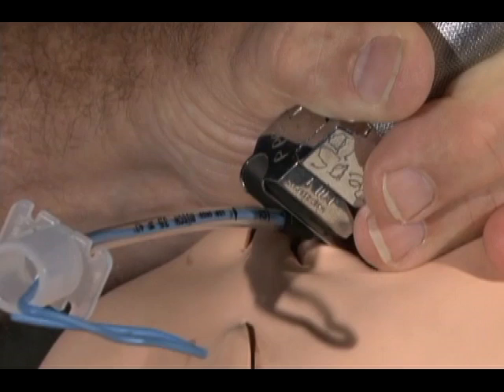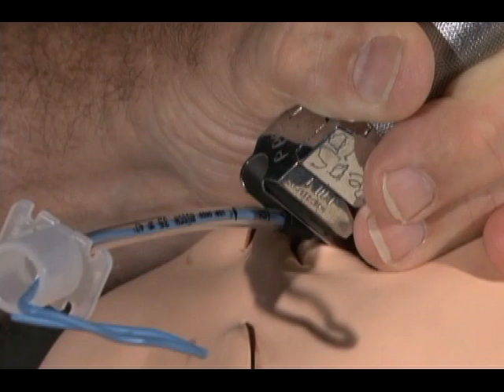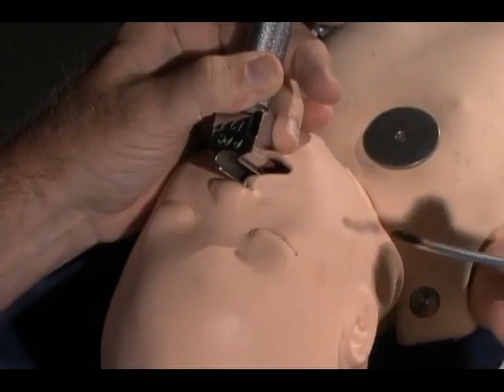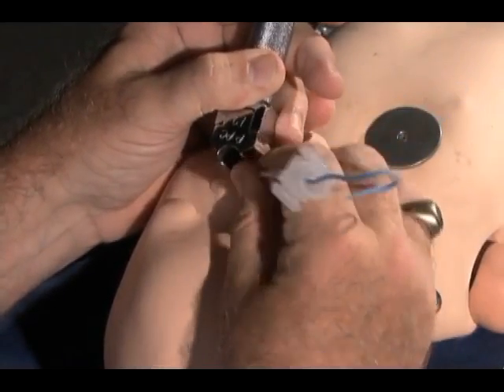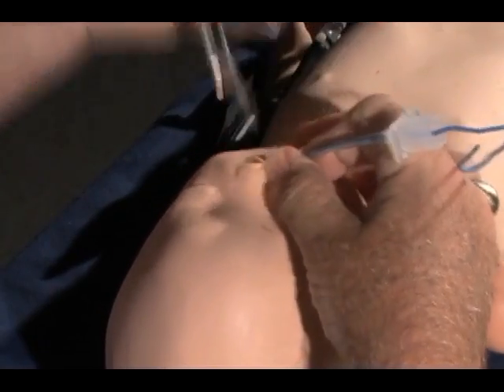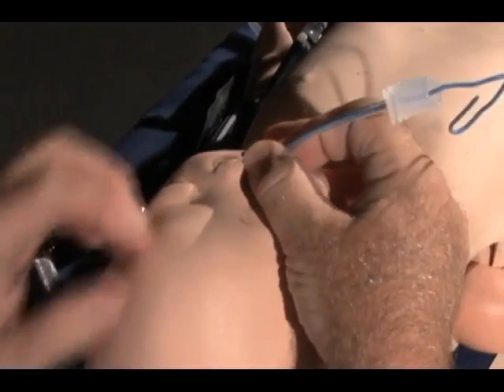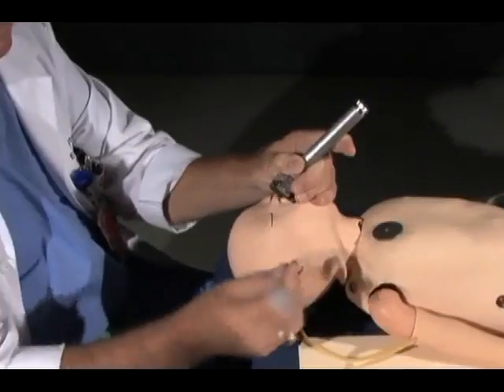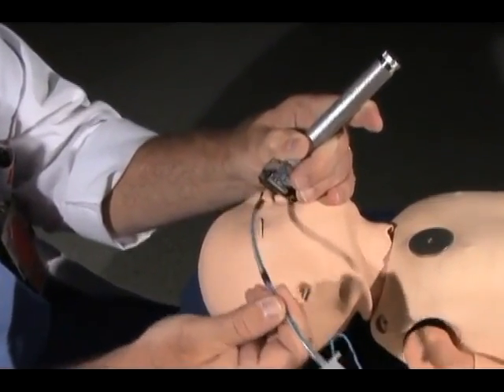To summarize: note the angle of sight used by the intubator; the tube is inserted entering from the side; stop at the tape lip-to-tip distance; the thumb naturally stops at the maxilla; keep the thumb fixed in place on the maxilla and hold the ET tube until secured. Here is the pediatric intubation in real time.